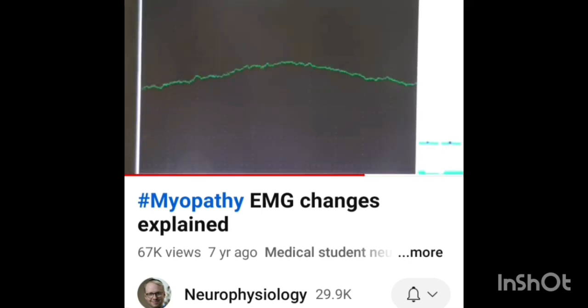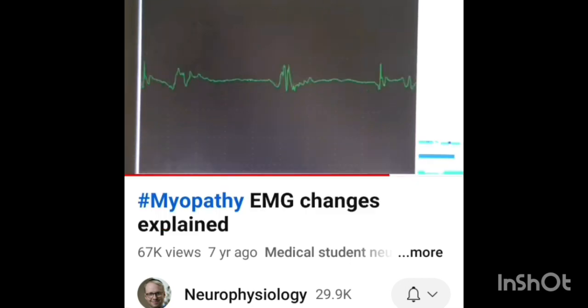I'm going to show you a great example of a myopathic muscle, and the first thing you're going to hear is actually a burst of complex repetitive discharges here. So the needle's just gone into the muscle, and you're now going to see what's happening. Not only are there CRDs, there are also some fibrillations here as well, and I'm now going to show you the motor units too.